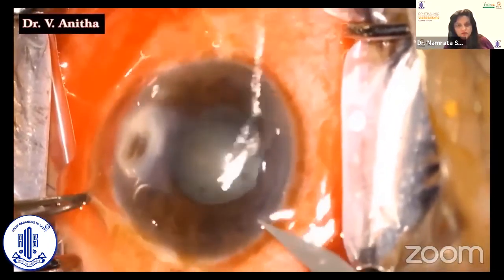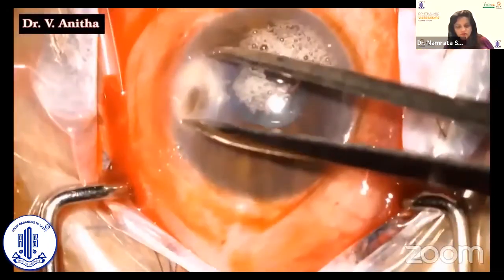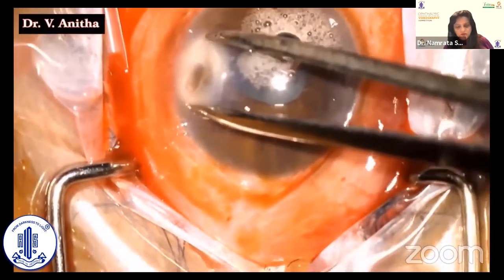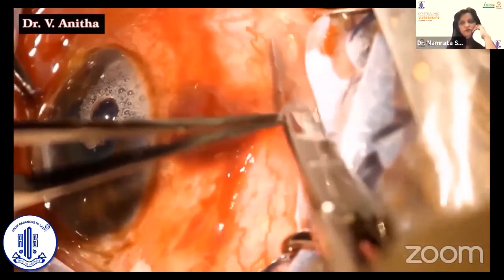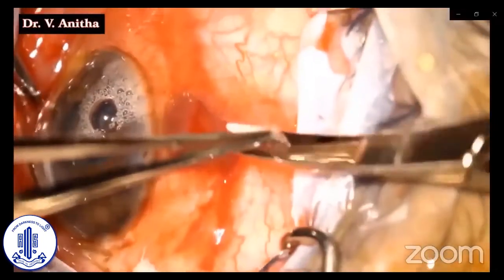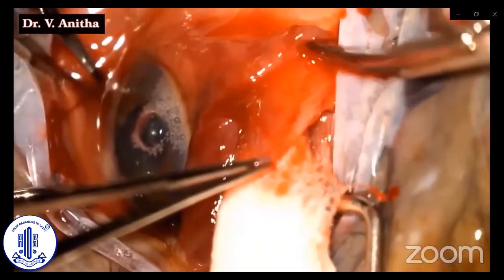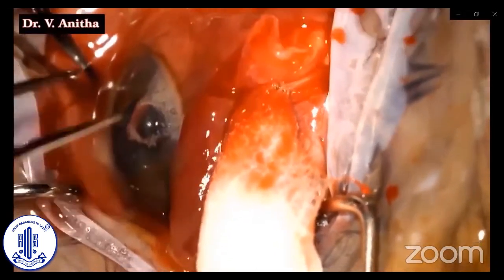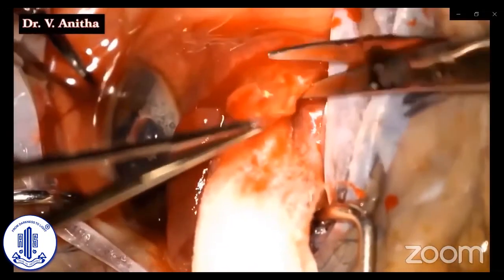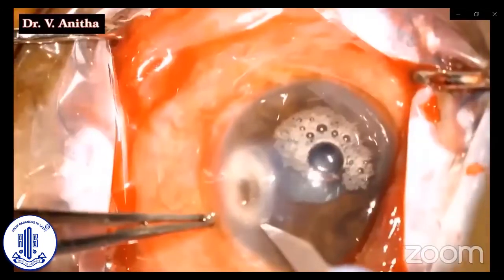Tenon's has many advantages. It is an autologous tissue, hence does not cause immune reaction or rejection. There is no heterologous antigenic sensitization, hence corneal grafting if performed later is more likely to succeed. It easily gets incorporated in the corneal wound, hence this tissue does not rely on the donor cornea or the eye bank.